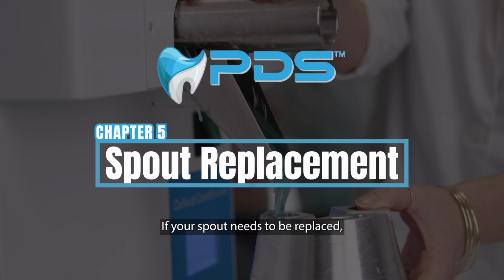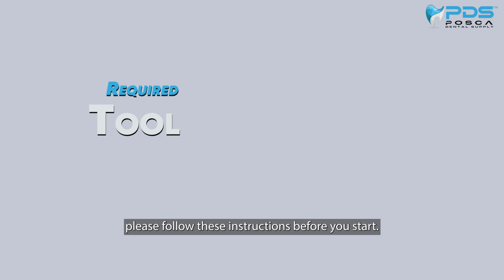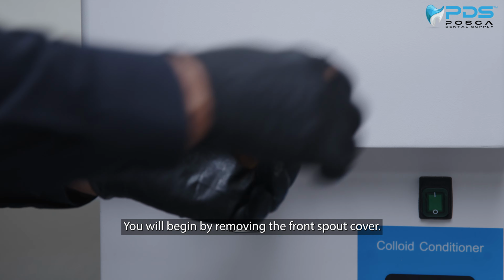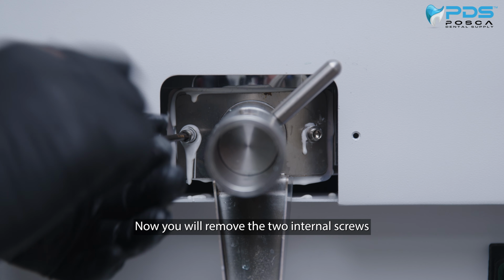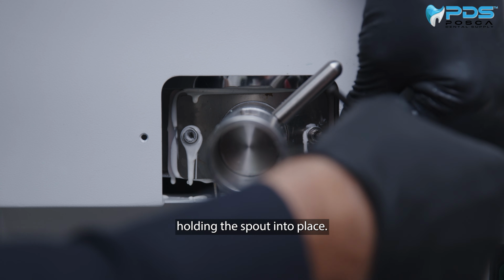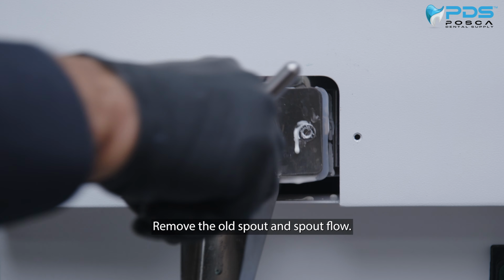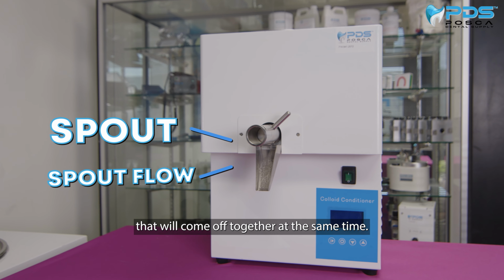If your spout needs to be replaced, please follow these instructions. Before you start, ensure you have the tools and necessary parts. You will begin by removing the front spout cover. Now you will remove the 2 internal screws holding the spout into place. Remove the old spout and spout flow. Note these are 2 parts that will come off together at the same time.